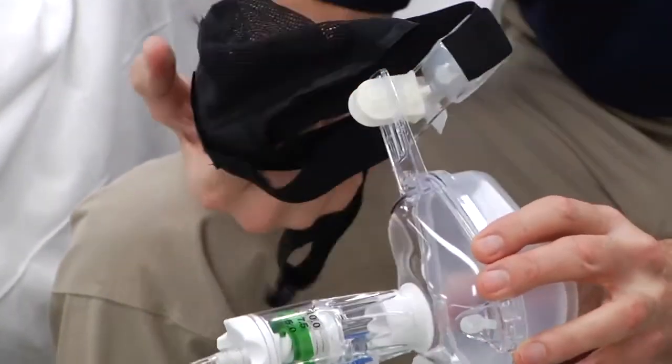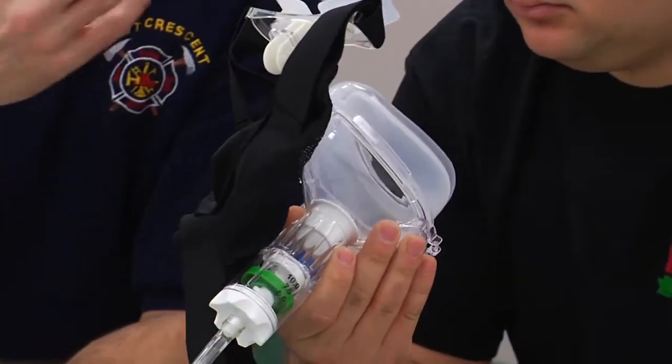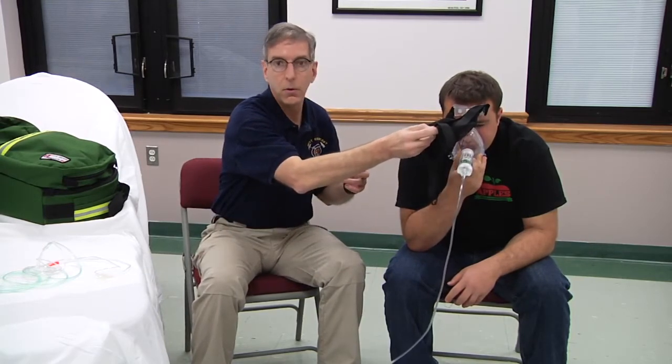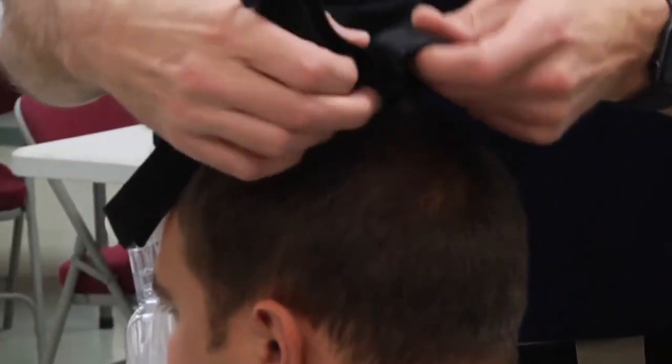Now, selling CPAP to the patient, in the sense of having them use this device, probably is best done by handing it to the patient and asking the patient to put the mask on their face initially. So you talk to the patient, you coach them, you help them to relax with the CPAP in place, and once they feel somewhat comfortable holding it themselves, you can then take the helmet or the accessory straps that hold the mask on and attach that to the patient.